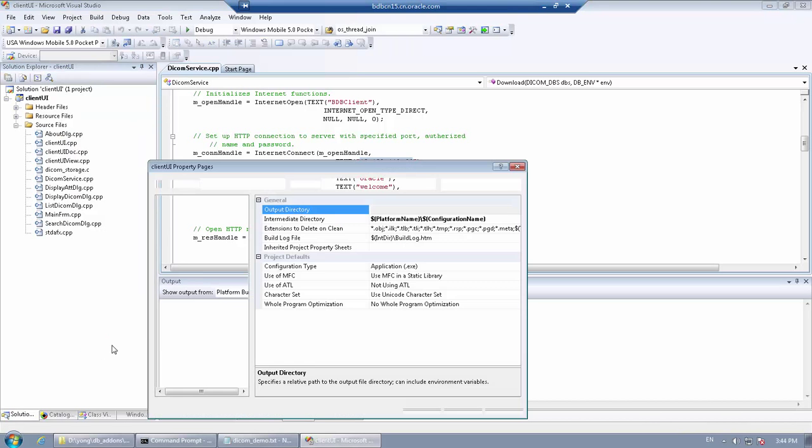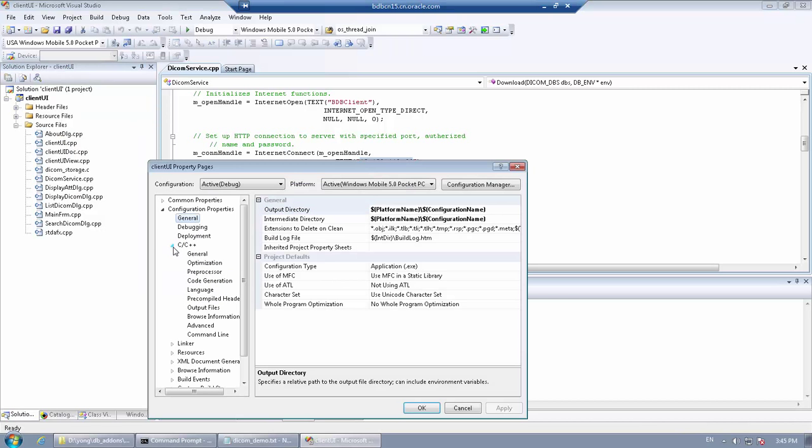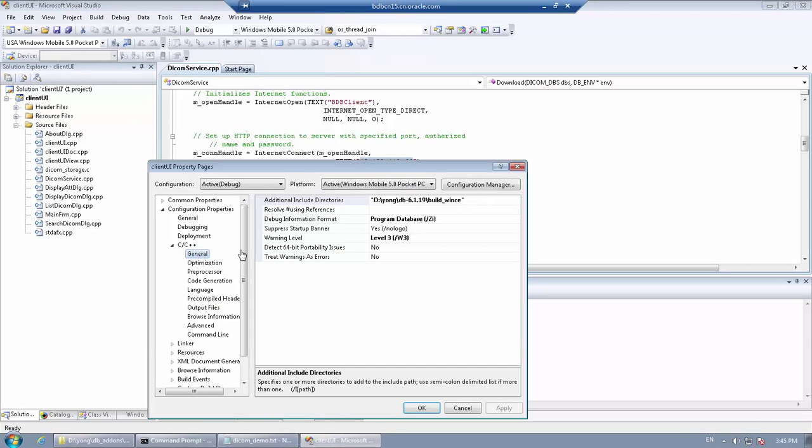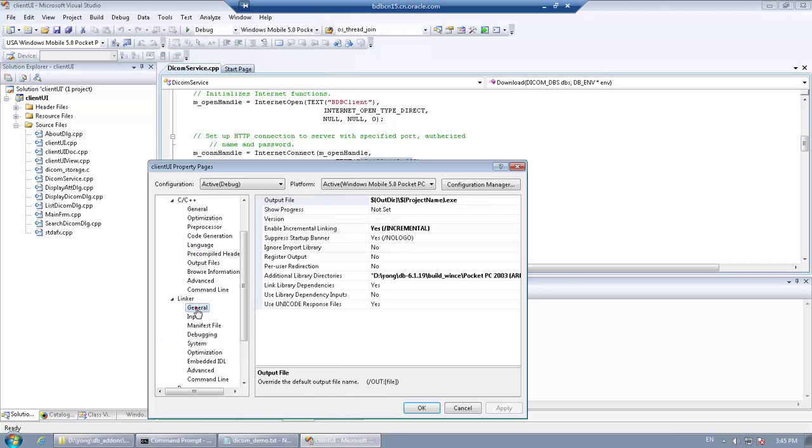You may also need to adjust a few properties according to your local environment. For example, the include directory and the library directory.